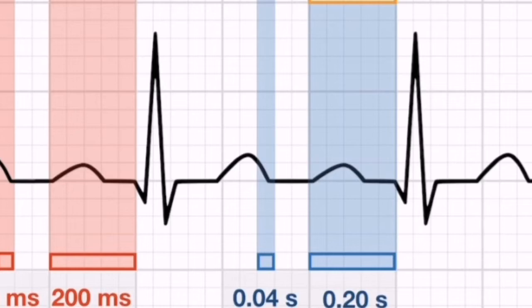Sometimes we get confused when we see the ECG on the monitor. I will try to make it simpler so we can differentiate the normal look of the ECG on the monitor and the serious one, which can lead to death if not discovered and treated early. And always don't look only at the heart rate number showing on the monitor. You have to see the shape, whether it is normal or not, because sometimes you will need immediate intervention.